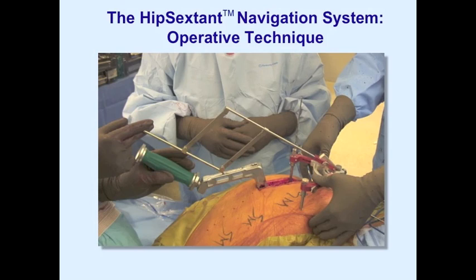When you first begin to use the instrument, you will sometimes find that the direction indicator is pointing in a direction that you would not have anticipated. If it is docked correctly, this means that the pelvis is significantly malpositioned on the operating table. If you feel insecure about the orientation, just double-check that the instrument is docked correctly.